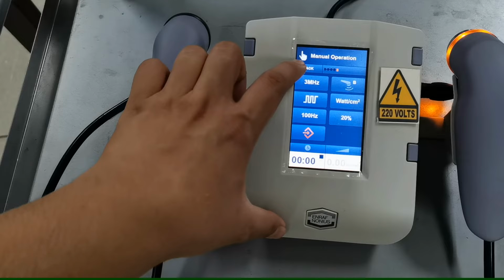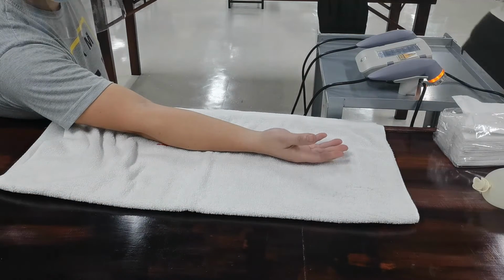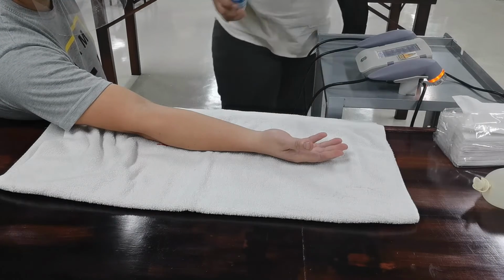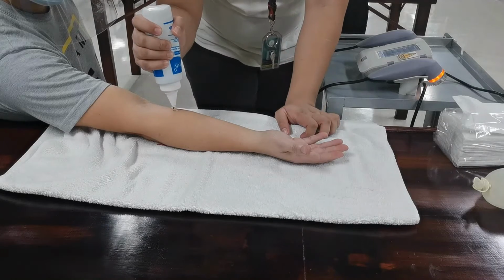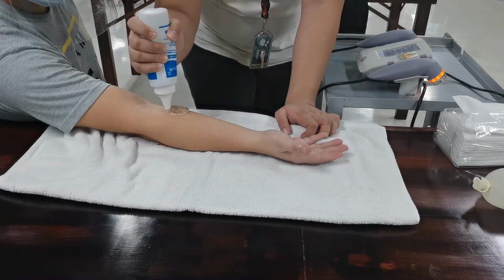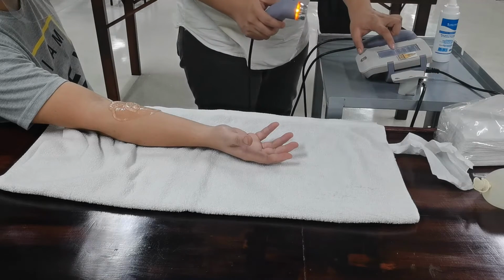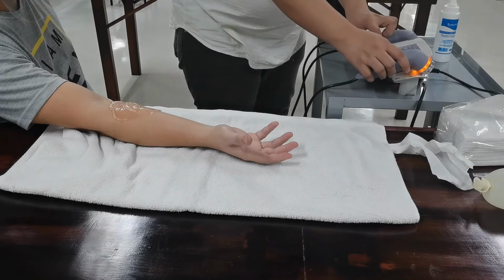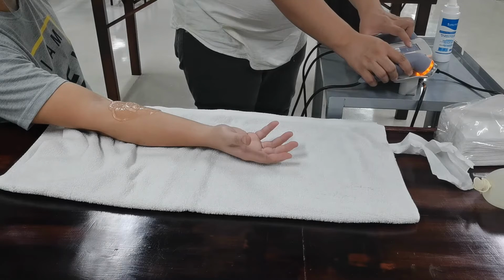Just to show you how ultrasound is applied. Apply the ultrasound gel. Make sure the ultrasound gel is enough to cover the area to be treated. Then manually set up the machine. Manually input the parameters on the machine.